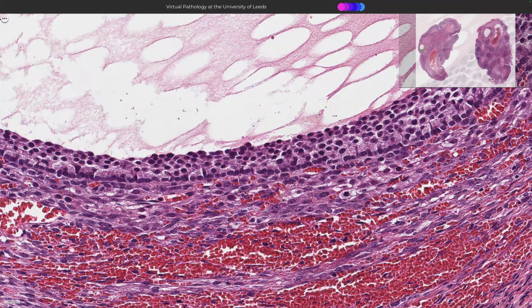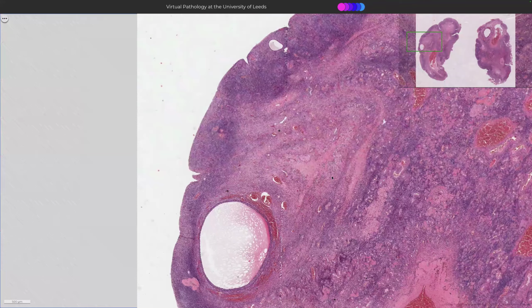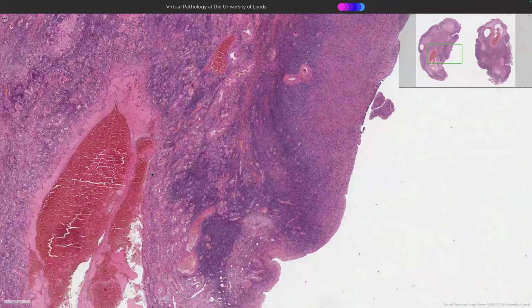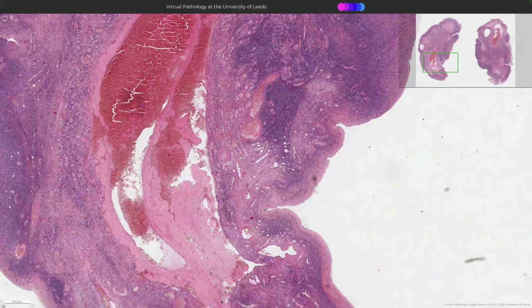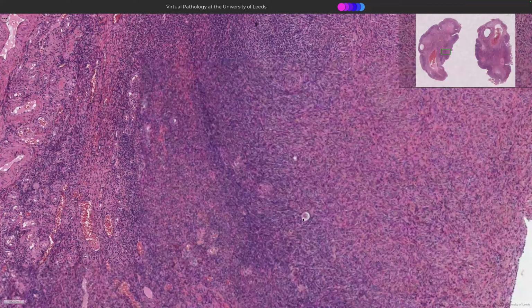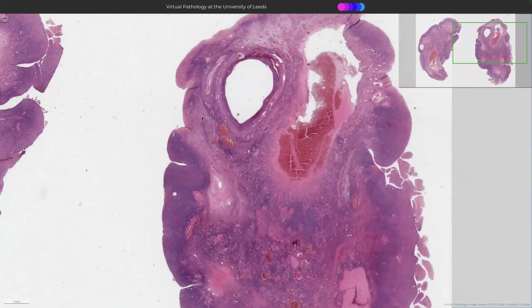And look at that mitosis there. They are growing. That's okay to find one. Okay, and then over here we've got the very typical hilum, and we're going to come round and notice some things like the large vessels. But I'm just looking here and there's nothing going on. And I know this is near postmenopausal because the number of these little primordial follicles is very low. So this is a postmenopausal ovary with very low numbers of primordial follicles, but still able to produce the occasional cyst. So here we go again, another follicular cyst.